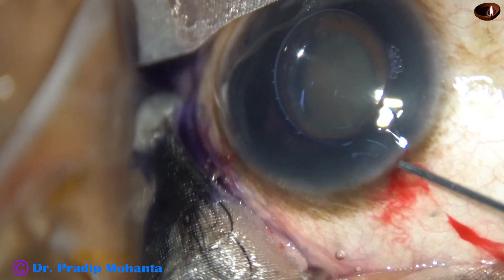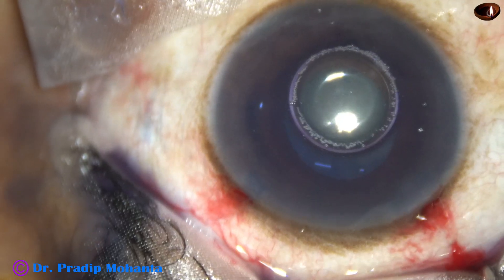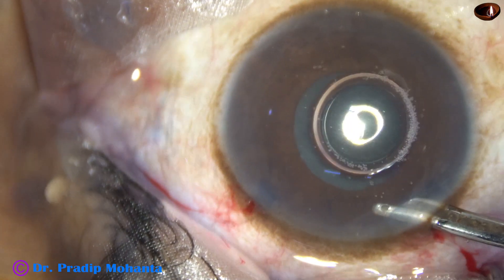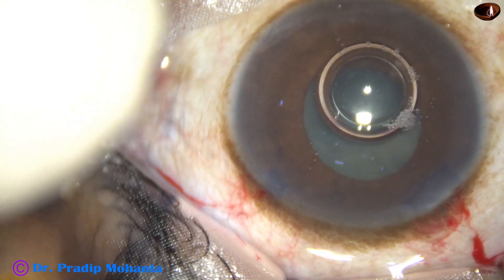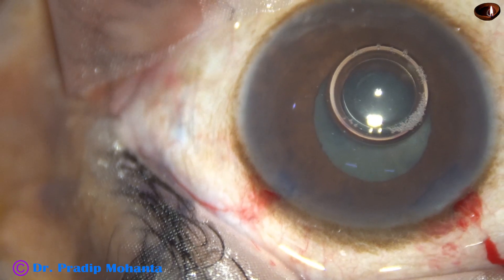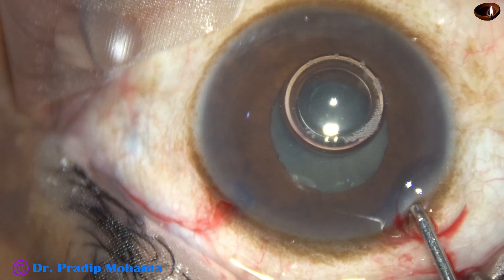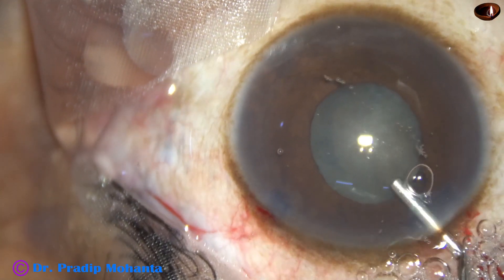The patient is under topical anesthesia. The main incision and a side port have been made. The anterior capsule has been stained with trypan blue dye. The dye is being washed out using BSS, and now 2% hydroxypropylmethylcellulose is used to underfill the anterior chamber.